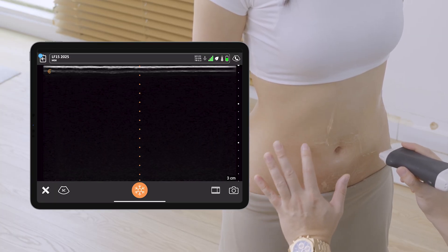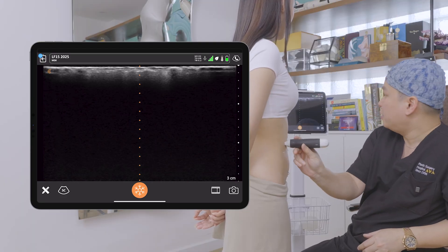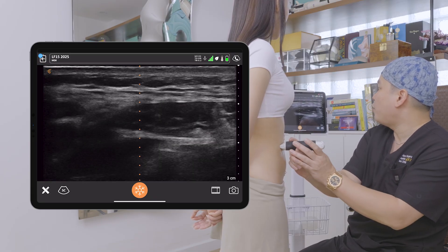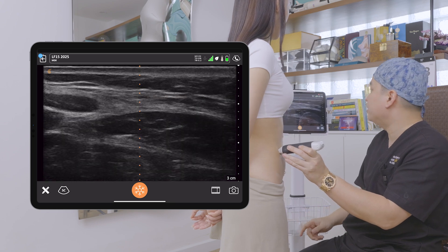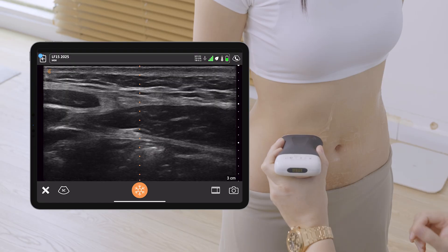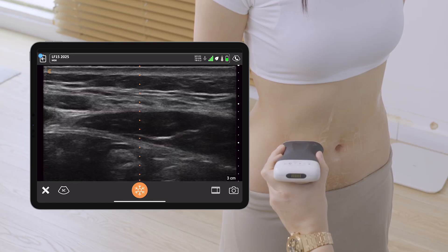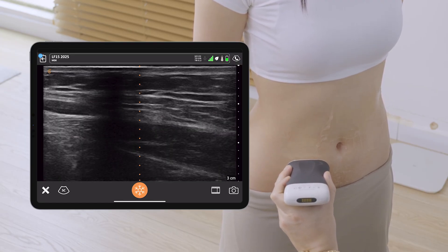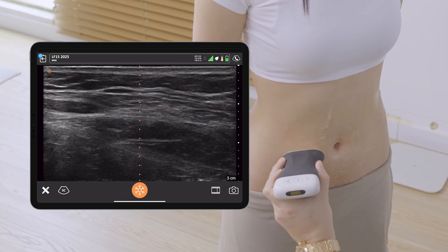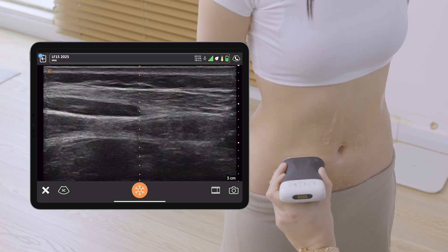In moderate definition, the line can stop around the umbilicus level, which she already has. We repeat the scan on the other side and you can immediately see that in the upper abdomen there are more subcutaneous tissues above the right linea semilunaris, so it's our job to expose it later on.